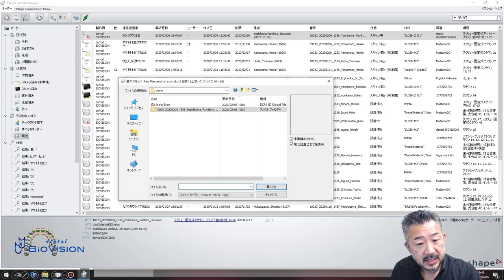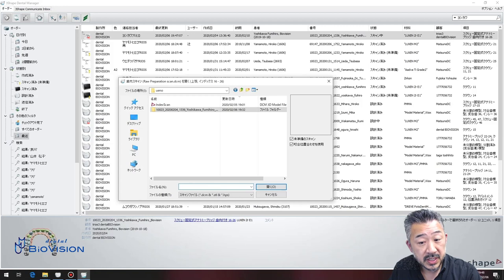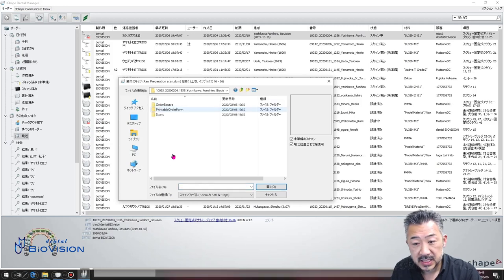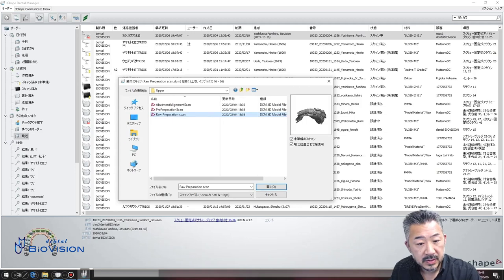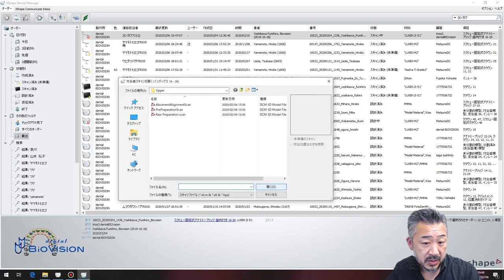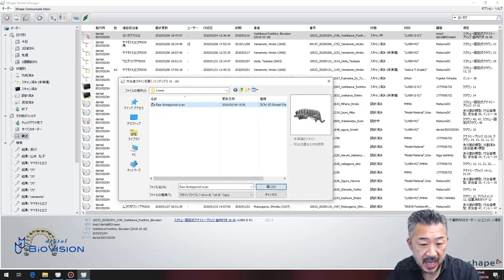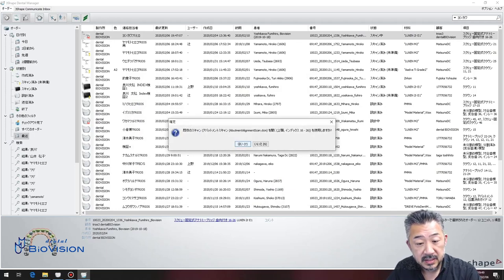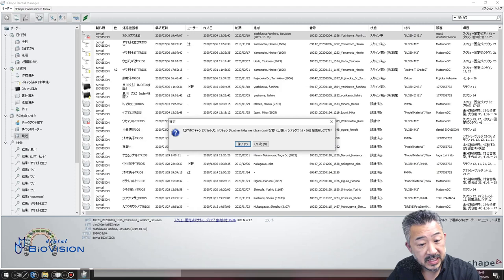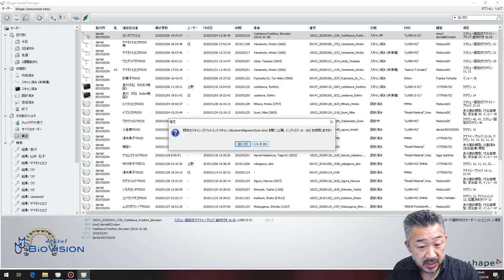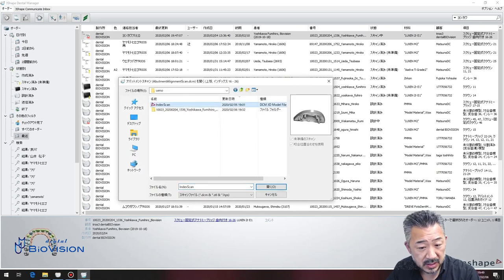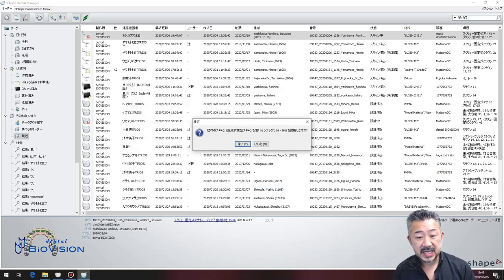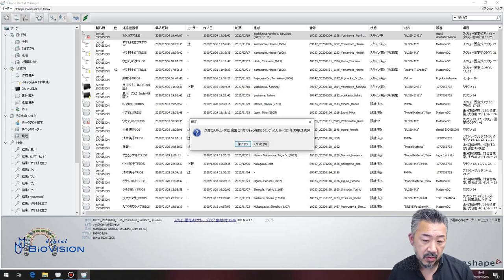This is displayed here. Select the data with abutment attached. Then import the opposing and use the occlusion alignment scan as is. Next, for the abutment alignment scan — this is important — import the scanned data of the index model. In other words, the exact implant position is reflected from the index model data. Then the order form is completed.